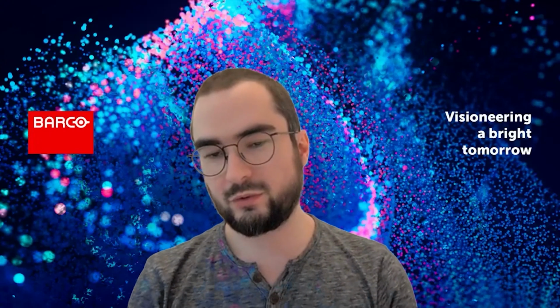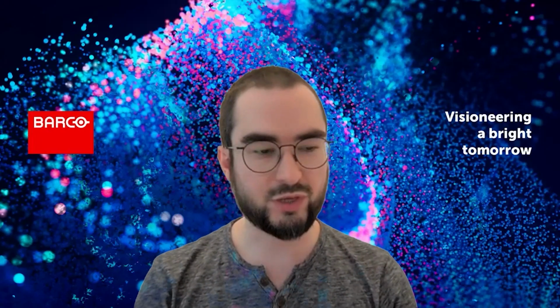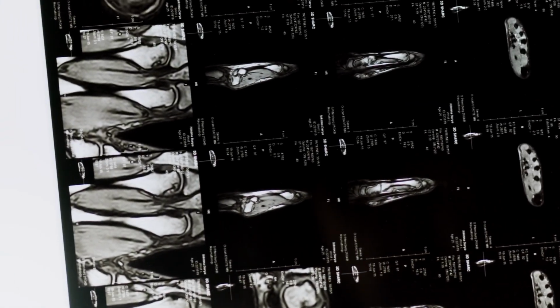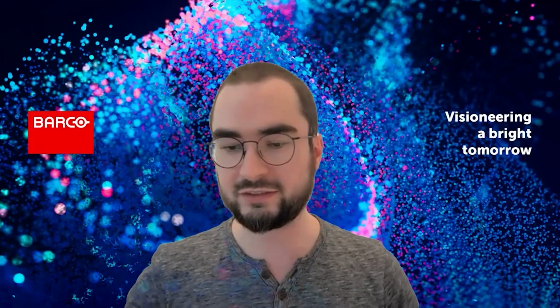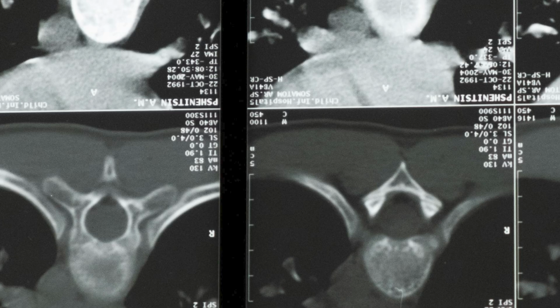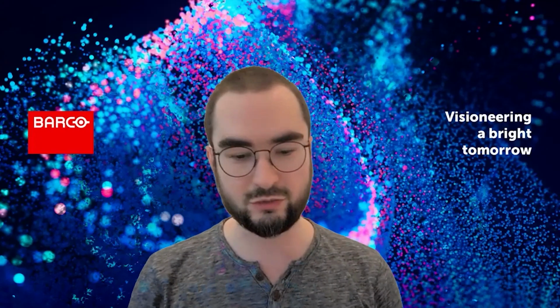So to answer this question, we really need to think about how this is being done today. Today, radiologists and surgeons use CTs and MRIs, which are all black and white images that are slices of your body, slices of your head or of your chest. Each slice represents an intersection, and it is a grayscale image. Radiologists scroll through these and try to understand the differences between the slices. They look for different subtleties and changes from one slice to the next to detect the tumor.